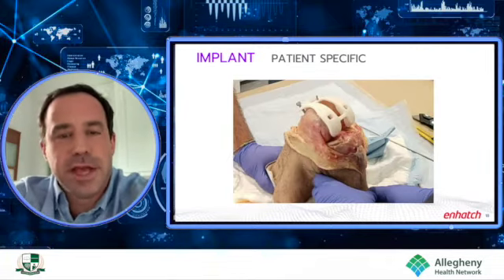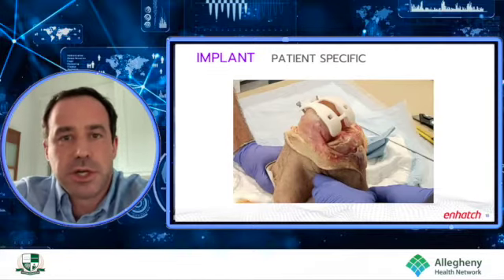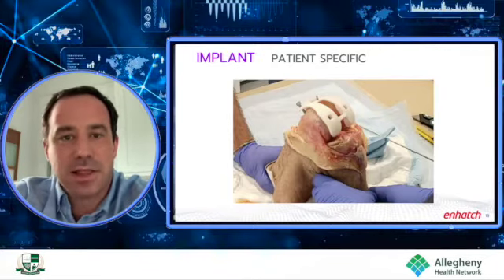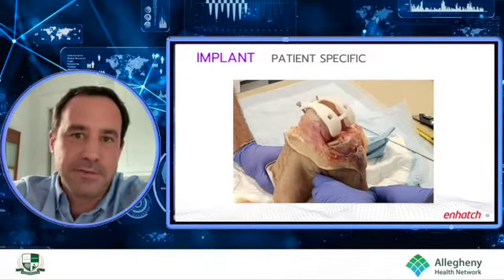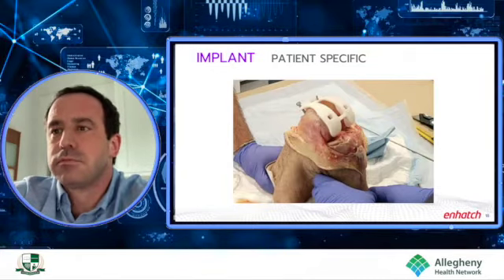So this is a situation where the technology is actually potentially eliminating the need for that three-dimensional imaging. So that's less radiation exposure for the patient, it's less cost, it's less delay for that surgery, while still providing a very high level of accuracy with those patient-specific guides. A situation where the AI essentially allows the technology that exists to become better, cheaper, and faster, and safer.